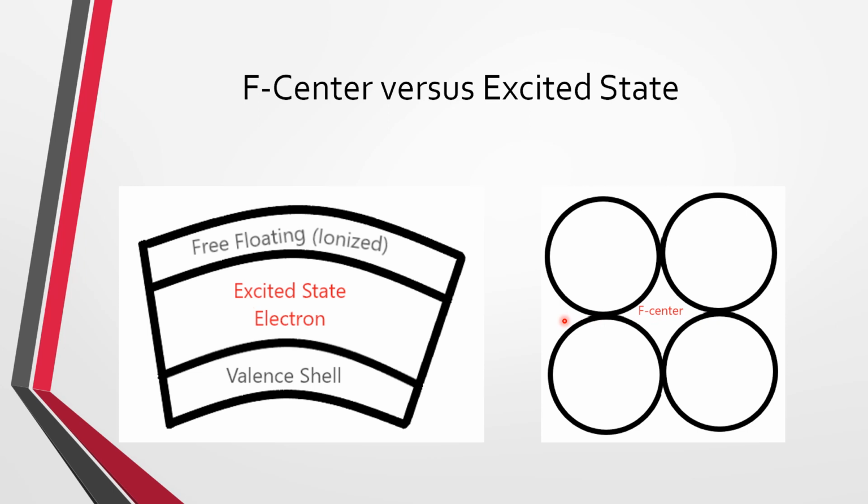It actually has to do with electron spin states and all this stuff, but we don't need to get into that. We just need to know that these terms may be used to describe the electron in the plate after exposure to X-rays and before the processing. They are the same, as we talked about.